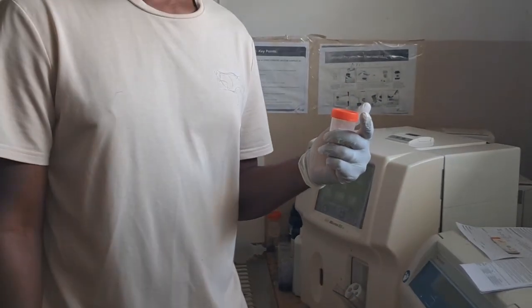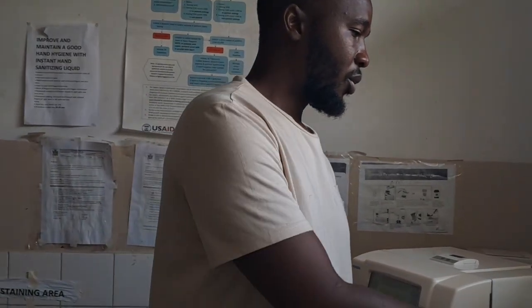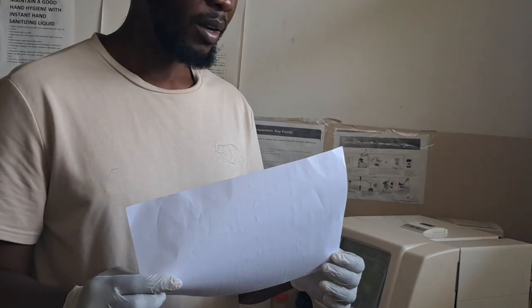You can order and we will provide the right specimen container. You also need to have a form. It's also part of collecting samples.